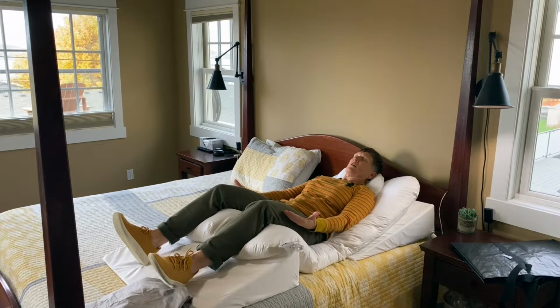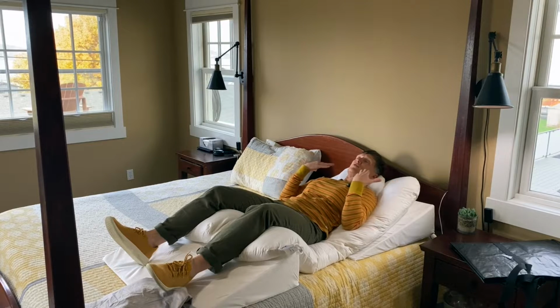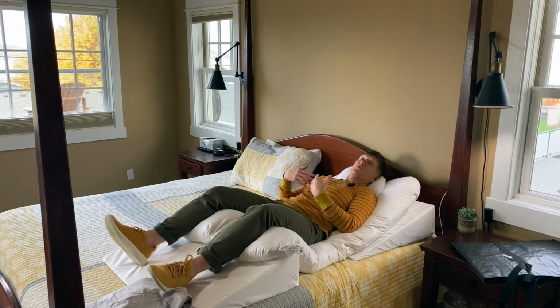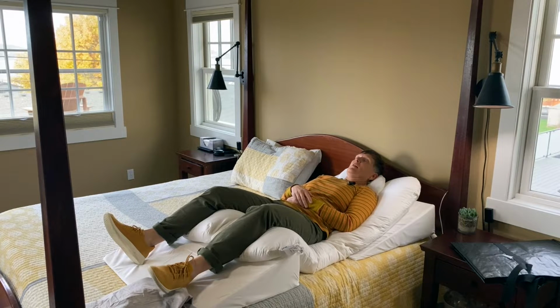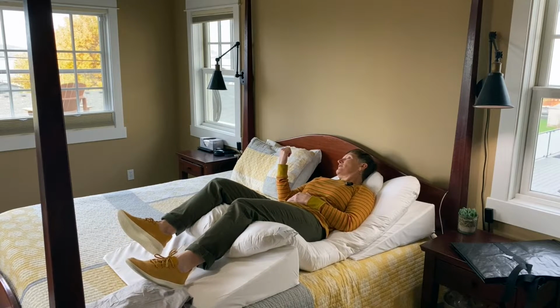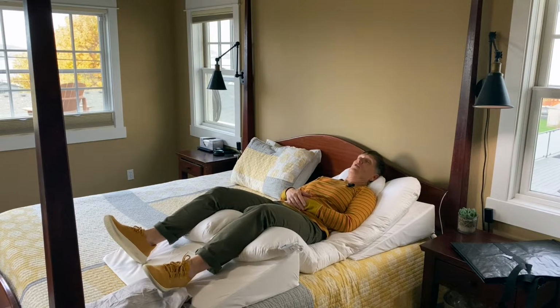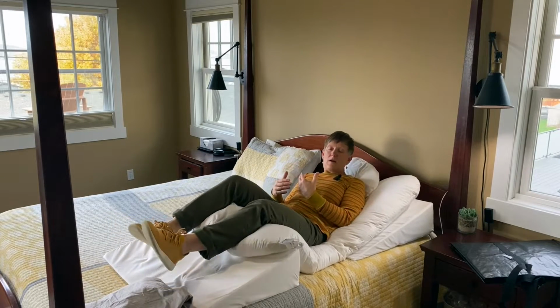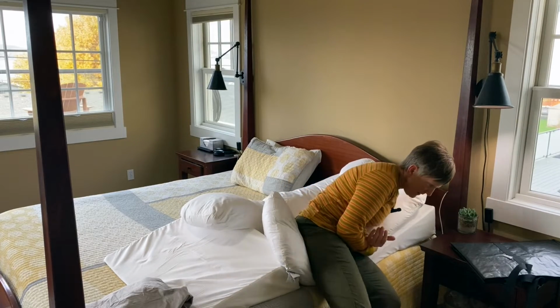So this bottom wedge is elevating my knees, which takes pressure off the abdomen. The top wedge is elevating my trunk, just going to help with swelling and drainage and recovery. And then being supported like this and being very nestled in, if you're like me, when you're asleep, you'll have a tendency to roll onto your side while you're sleeping. This is really going to prevent that from happening. I really can't roll onto my side in this position. So that's going to help protect you and optimize your recovery. So to get out, we'll just swing those legs out and come up to sitting.